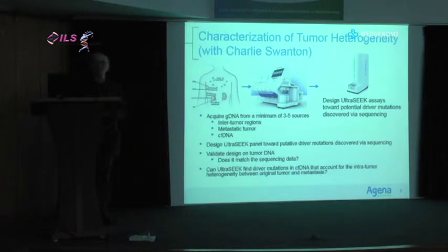It's one of the problems with NGS in cancer. It's not a lookup table like prenatal. It requires a lot of analysis. And then he gives us the data file after he's figured out which are the false positives and which are the true positives. And typically there are 5 to 20 or 30 unique or common mutations in that patient. And we design a custom MassARRAY assay to look for those mutations in the same patient sample. And it takes us 3 to 5 working days to design the assay and run it, okay? So you can see how much faster this is, and of course it's tremendously cheaper.